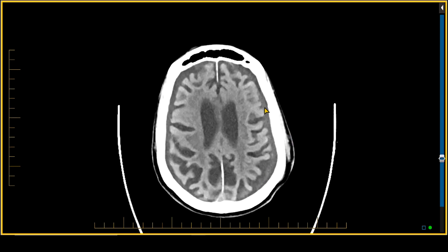Remember that as the hematomas age, they get less and less dense. Therefore, these low-density collections that can be seen here are likely weeks to months old.